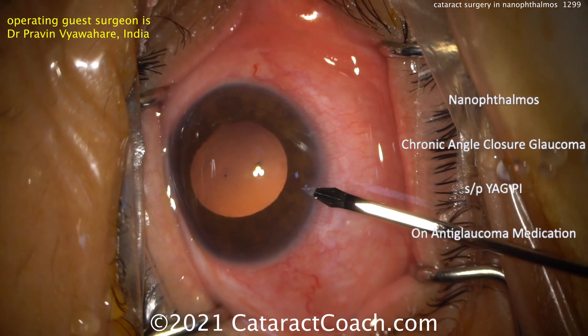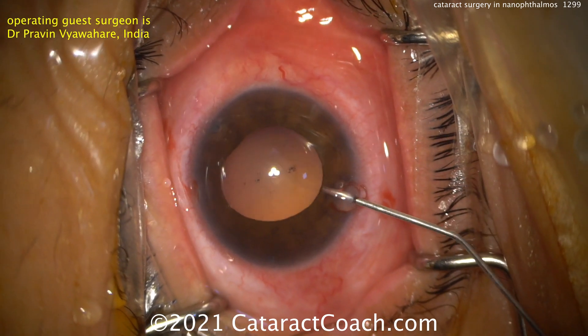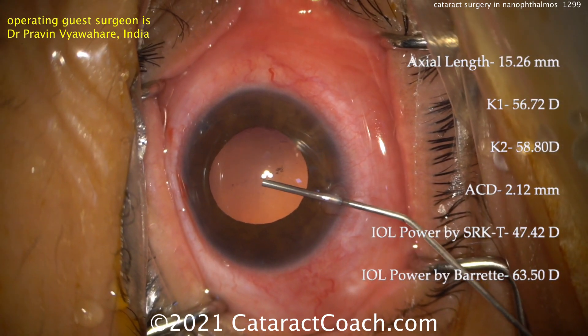The patient has chronic angle closure, with a status post YAG PI, and is on antiglaucoma meds. Two paracenteses are being made at the very beginning, with a little bit of viscoelastic. Be very careful here.